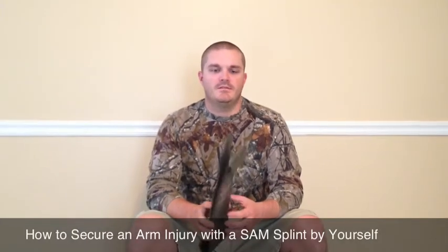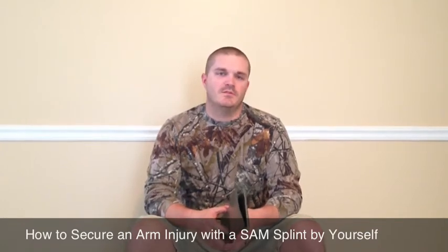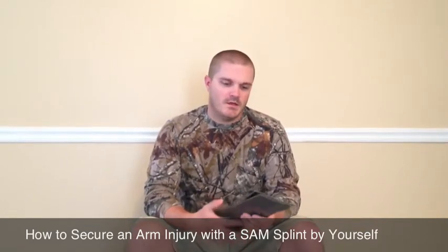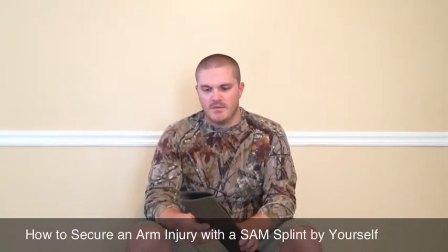Today I'm going to be talking to you about the SAM splint and how to use it to properly splint a broken arm, either on yourself or someone you're with. The great thing about these is they're made by North American Rescue and SAM Medical together.